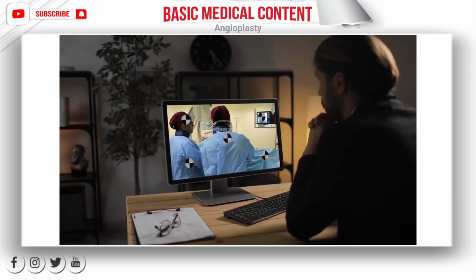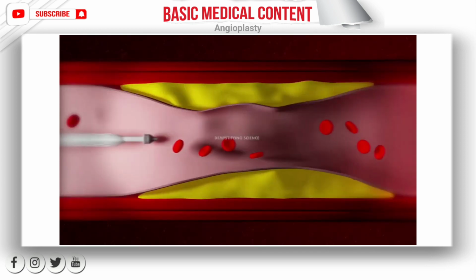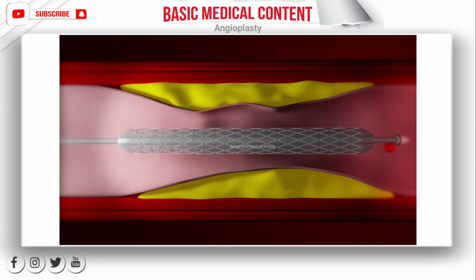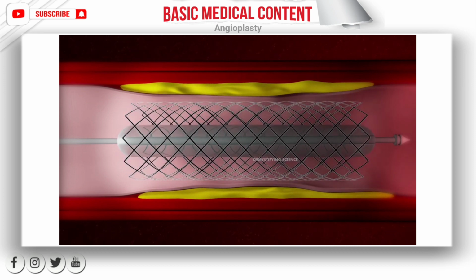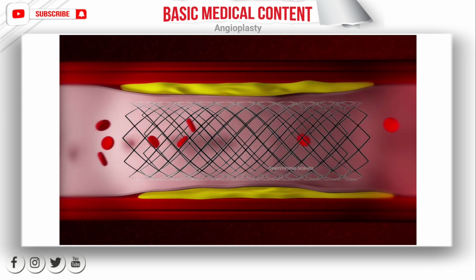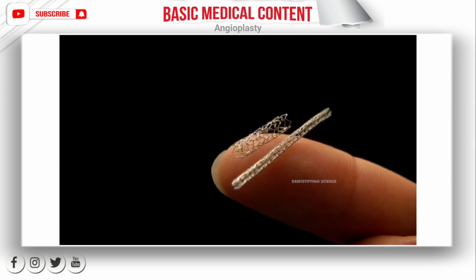What happens during a stent placement? The stent expands and locks into place inside the artery. The stent stays in the artery permanently to hold it open and improve blood flow to your heart. In some cases, more than one stent may be needed to open a blockage. Once the stent is in place, the balloon catheter is deflated and removed.